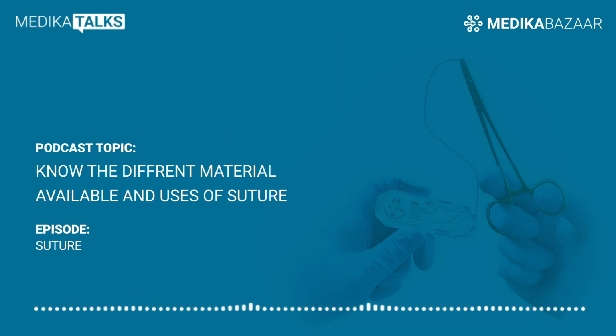There are several factors to be considered while choosing the type of sutures and materials, which include the patient's personal preference, the tissue type, and the infection risk. So, the practitioner needs to make the decision wisely.